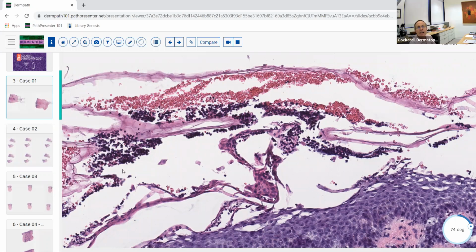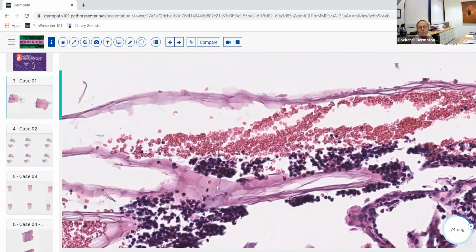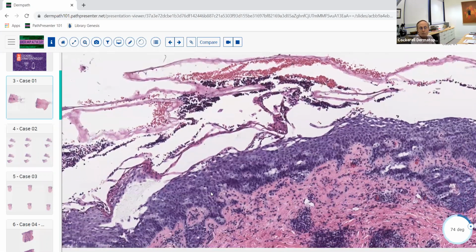And if you do a gram stain, you may or may not see any organisms here. So again, you can have a relatively few number of bacteria release quite a bit of epidermolytic toxin that can cause the blister, but you can't always see the organisms in the blister space with the gram stain. If you see it, it's great, and it helps you make the diagnosis. If you don't see it, it doesn't mean that it can't be bullous impetigo. But the most important thing is just to know the pattern here: the superficial acantholytic changes with the neutrophils and the subcorneal pustule.